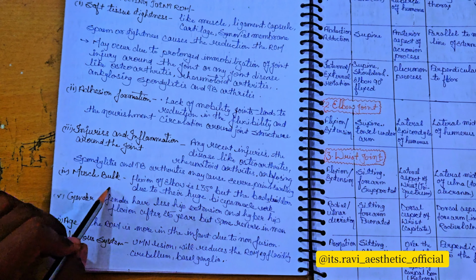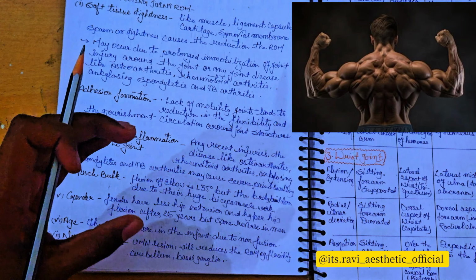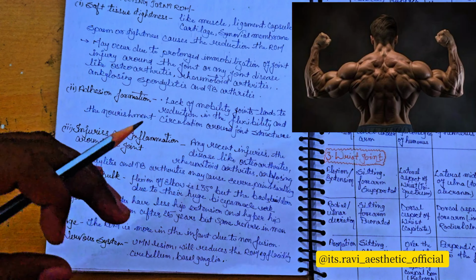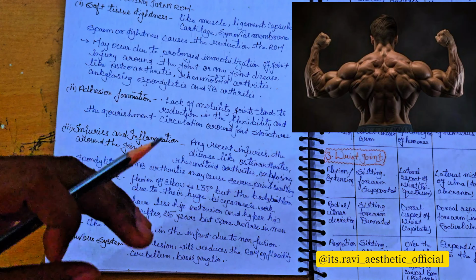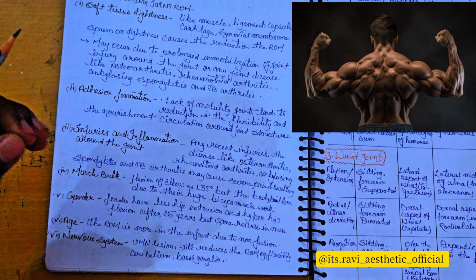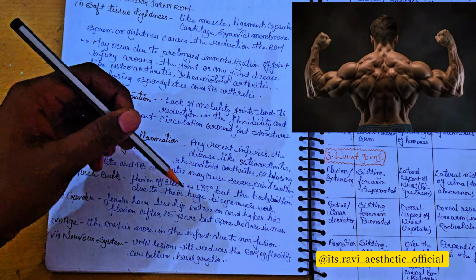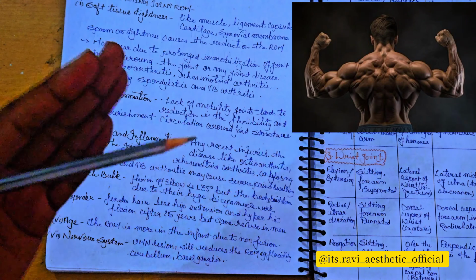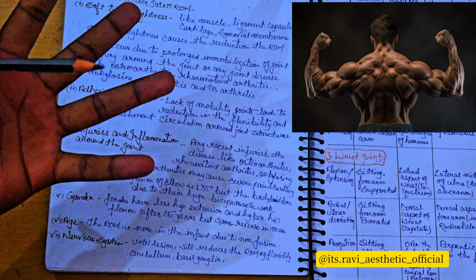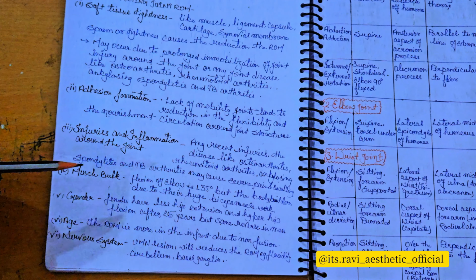Next, muscle bulk. There is muscle bulk in a healthy person, so it is difficult to measure what range is actually present in their body. An experienced therapist should have the knowledge to measure the actual range of motion in a healthy person. Flexion of the elbow is 135 degrees, but in bodybuilders, due to their huge biceps muscle, the range may be reduced to 130 or 125. This is not a patient, it is a bodybuilder. It is reduced due to muscle tightness and muscle bulk, and we can't measure beyond that.